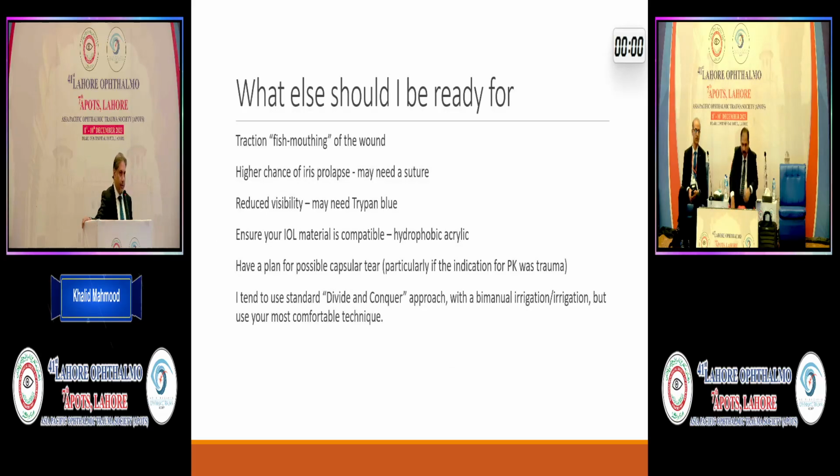What else? You should be ready for the distortion, fish-mouthing of the wound, because the wounds are soft, so there are high chances of iris prolapse. You may need an additional suture. Reduced visibility may need trypan blue. Ensure your IOL material is compatible, that's the hydrophobic acrylic, and have a plan for possible capsule tear. And I tend to use the standard divide and conquer approach with bimanual irrigation or with your Simcoe.